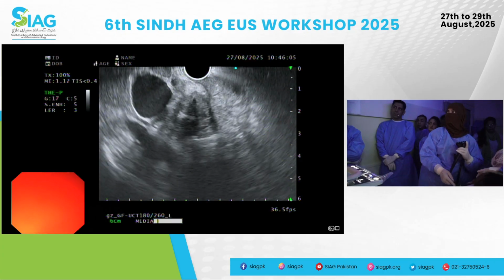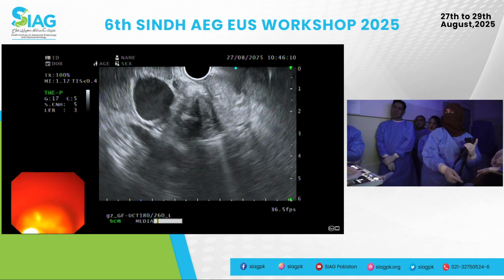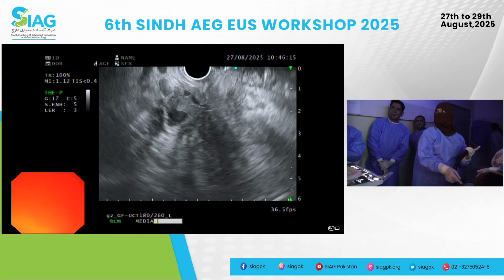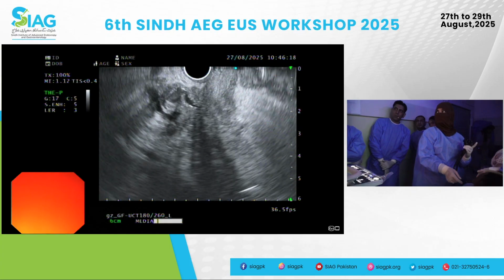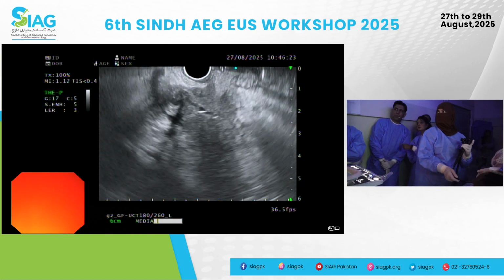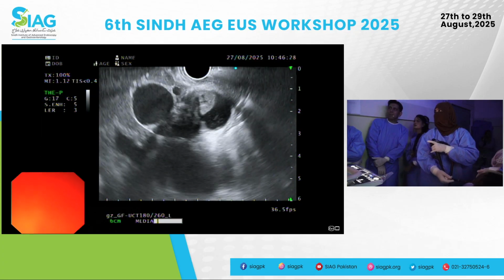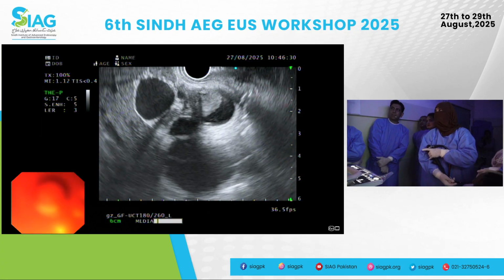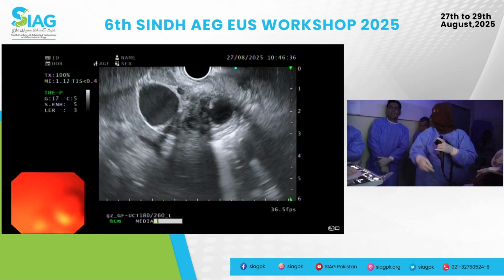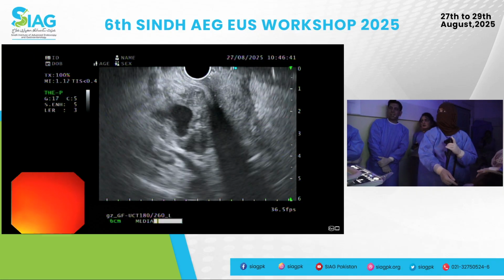Very nice. Good. Keep maintaining your views. Pull or push? No, no, no. You don't need to pull or push at this stage, unless it moves away from you, then you may have to do it. So you end up on the area of abnormality, the mass lesion that we know already. Yeah. A white shadow is coming, that's from the stent, isn't it? Yeah, exactly. Clockwise, clockwise, clockwise. That mass should come from this side. I mean the abnormality. Sometimes because of the distortion, you may not get it in the same plane as you were expecting.